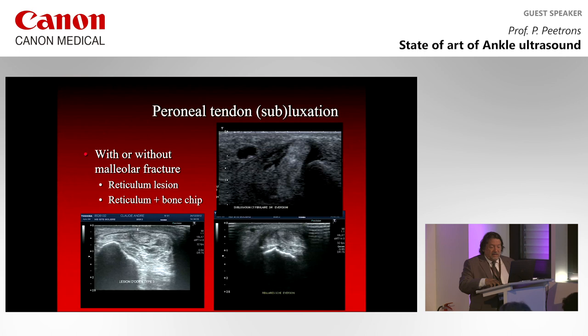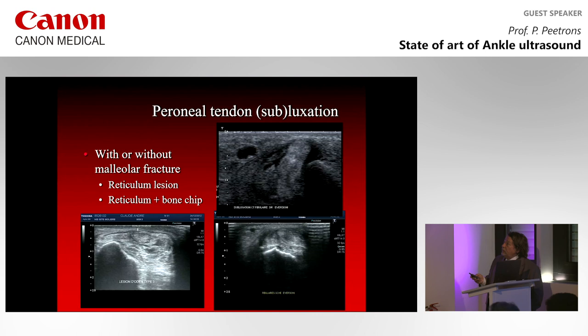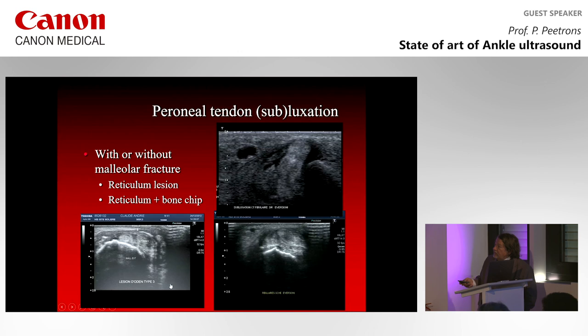Subluxation: I told you, you have to do the eversion maneuver, and you try to find whether some tendon, one or two, or both, can go between the skin and the fibula. Normally, it's not like this. And in some cases, you can see something very special. You can see here the peroneus brevis, and you see a bony structure there. I don't know if you know what it is.